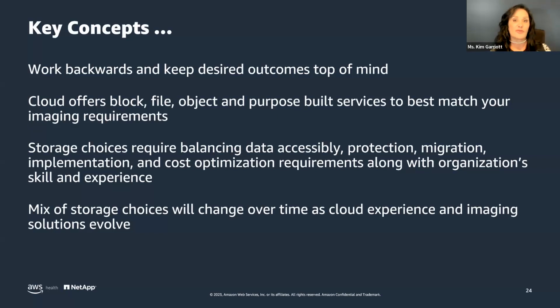That cloud offers any type of protocol for storage and purpose-built services to best meet your imaging requirements and the requirements of your software vendors. And that you really need to look at balancing data accessibility, protection, migration, implementation, and cost requirements, along with what your organization's skill and experience for the cloud is.